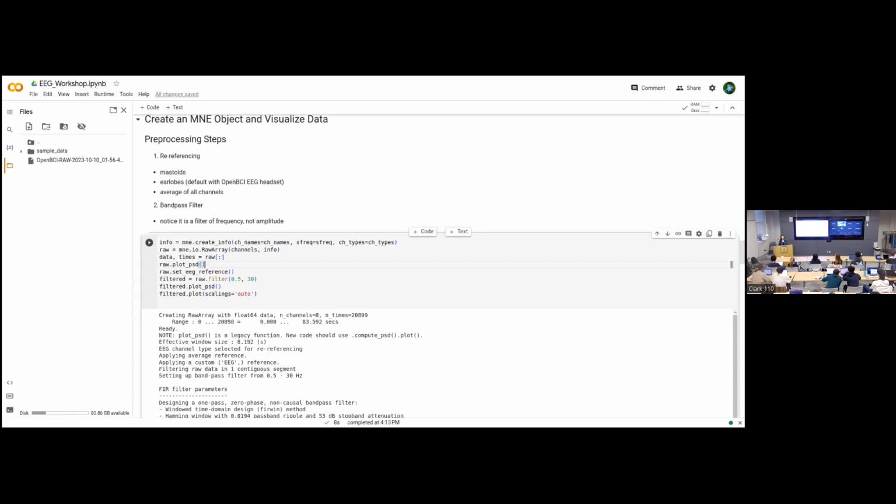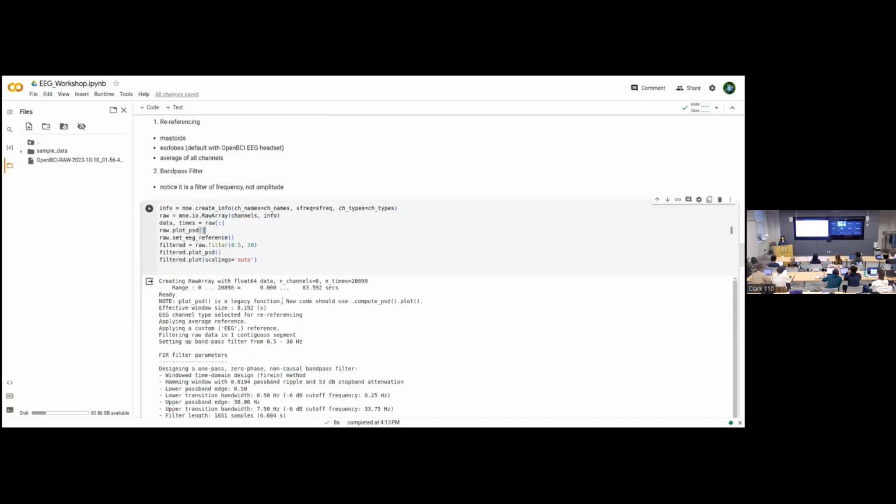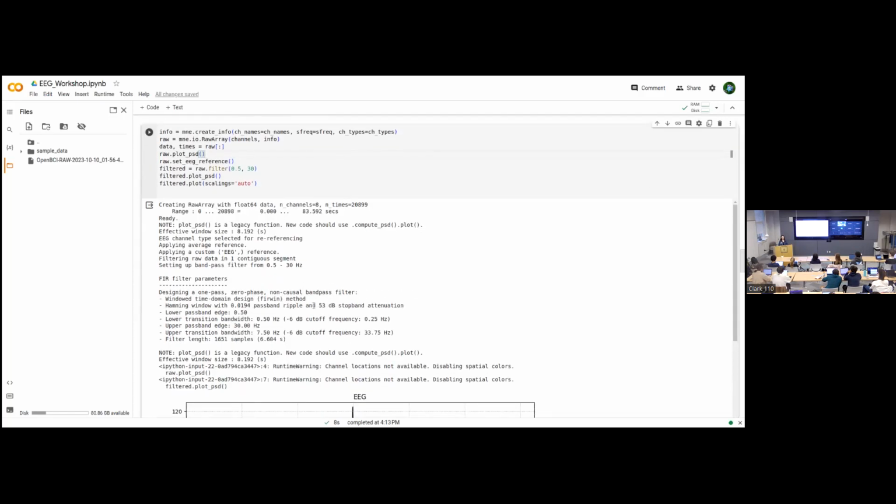It's actually frequency. Your electrical activity wave is actually waves of many different frequencies layered on top of each other. You have low frequency waves, which have a bigger period, and high frequency waves like this. When you layer them on top of each other, you get the electrical activity that you actually record. But some of the very high frequency signals are just pure noise, so we're going to filter that out with a bandpass filter.